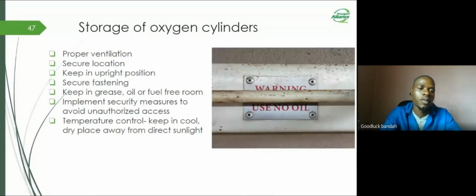It's also important to keep oil, grease, or fuel away from this room to avoid eruption of fire. And it's so important to implement security measures to avoid unauthorized access to the room that you are keeping the oxygen cylinders in. Not everyone should have access to the room. It's also important to keep temperature control in the room where you are keeping your cylinders. We know that temperature will increase pressure, as I've already said, and that will increase the chances of explosion.